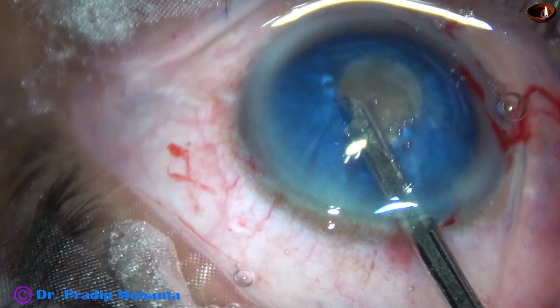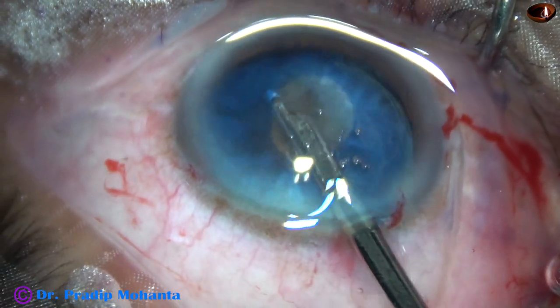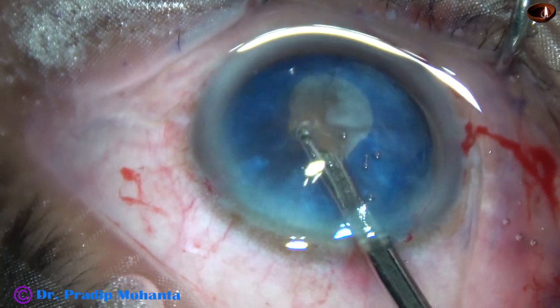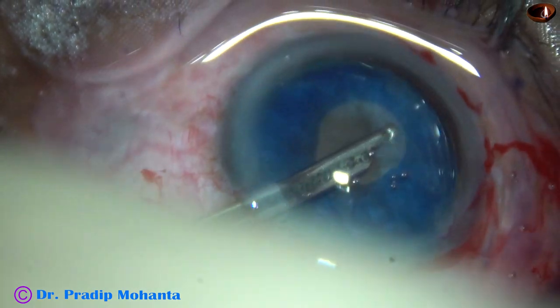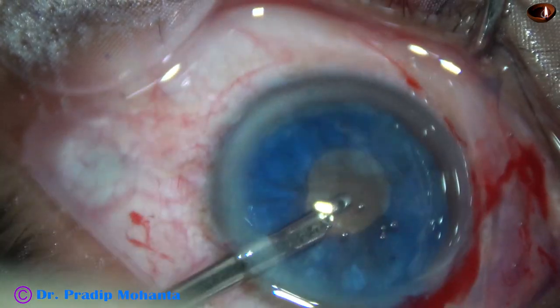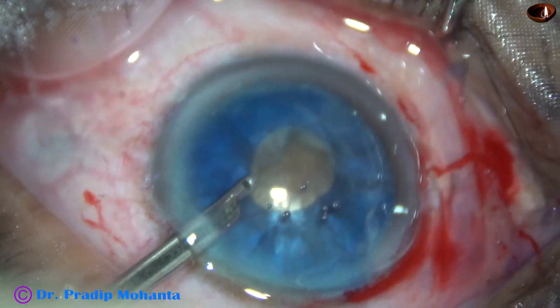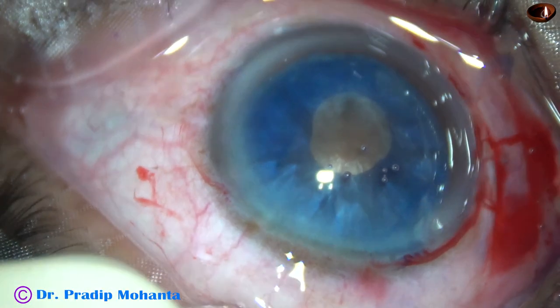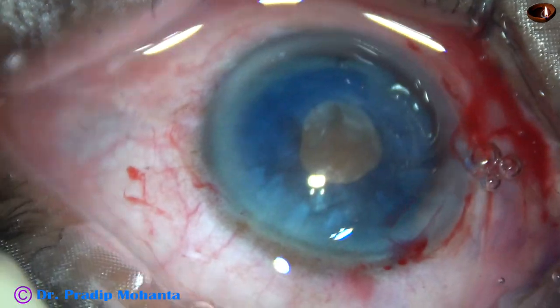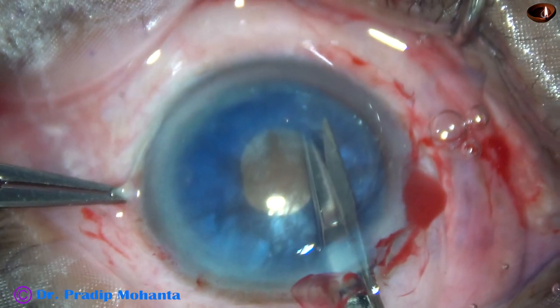Nucleus sclerosis — definitely grade 5. Hard brown nucleus, or even harder than that. Reducing the intralenticular pressure by aspirating some lens matter, some cortex, going through the left side port. Adequate amount of lens matter has been removed to reduce the intralenticular pressure significantly, so that the rhexis doesn't run out to the periphery.